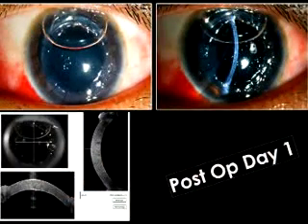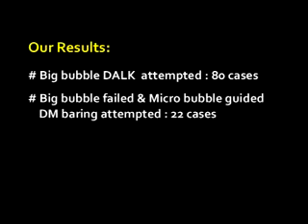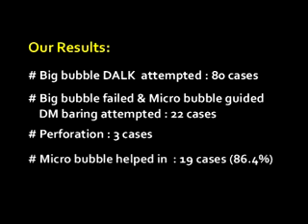On the first postoperative day, the graft showed perfect apposition. A retrospective analysis of our 80 cases undergoing DALK procedure showed microbubble technique in 22, where big bubble technique failed initially. 3 cases with microbubble technique ended in perforation. Microbubble helped in successful completion of procedure in 19 cases.